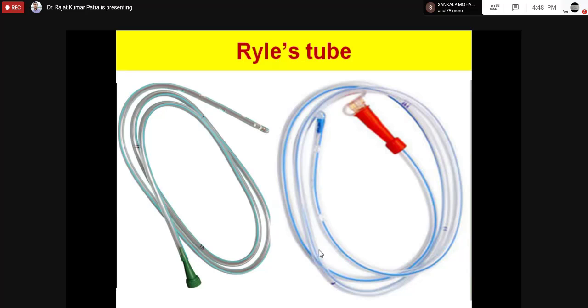So there are 3 demarcations you'll see, okay. Black line is there, okay. What is the use of the black line? Anybody? What is that marking? Where do you get this marking? What level? That is 50, 60 and 70, okay. You will get 3 markings, 50, 60 and 70, okay.